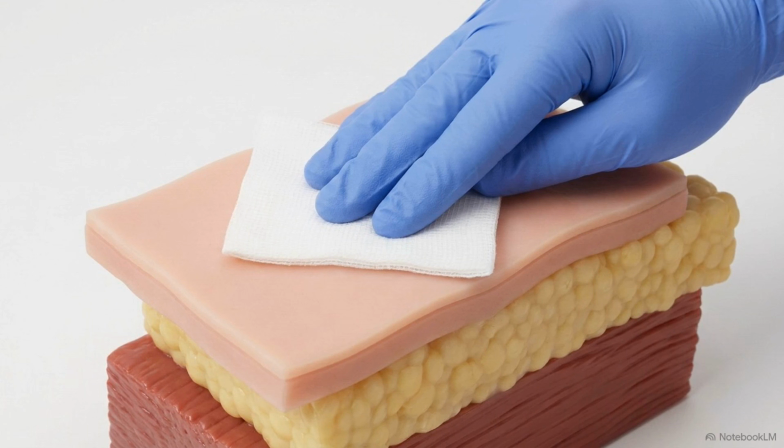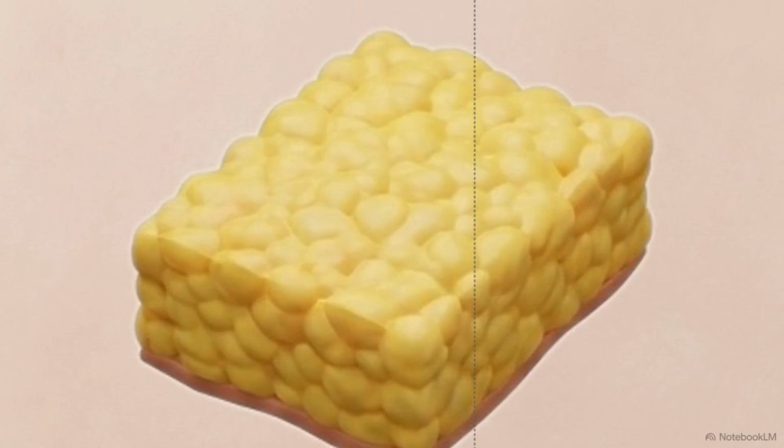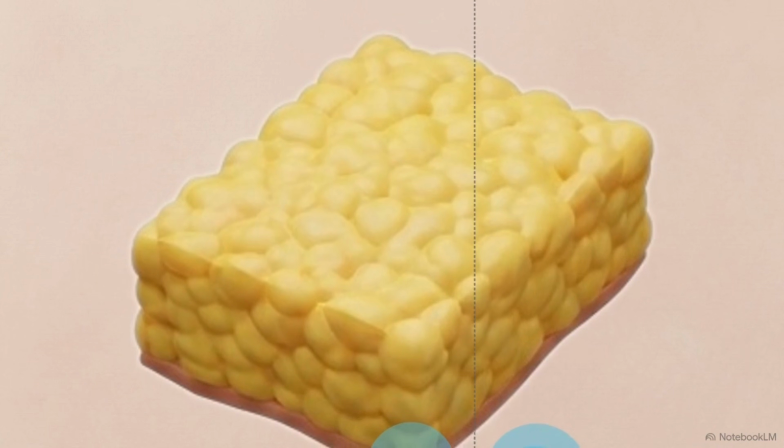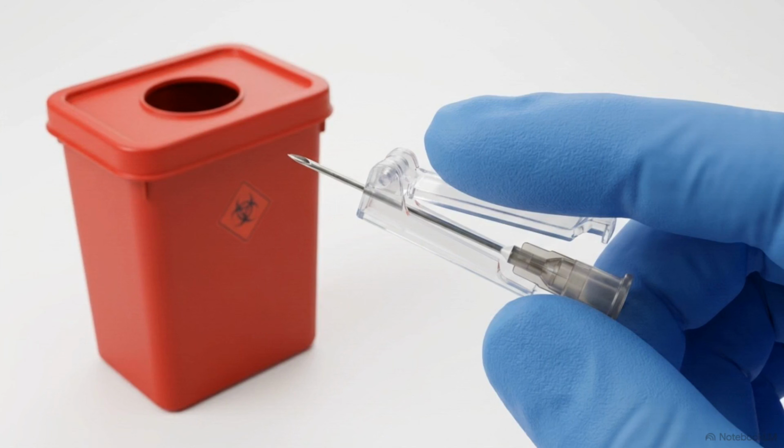Apply gentle pressure with a dry gauze pad, but do not massage the site. Massaging the injection site generates pressure that can force the medication through the zigzag seal and into the subcutaneous layer. Engage the needle's safety mechanism immediately and place it into a sharps container before removing your gloves. A correctly performed Z-track injection will leave the skin surface dry, with no bruising or medication staining.